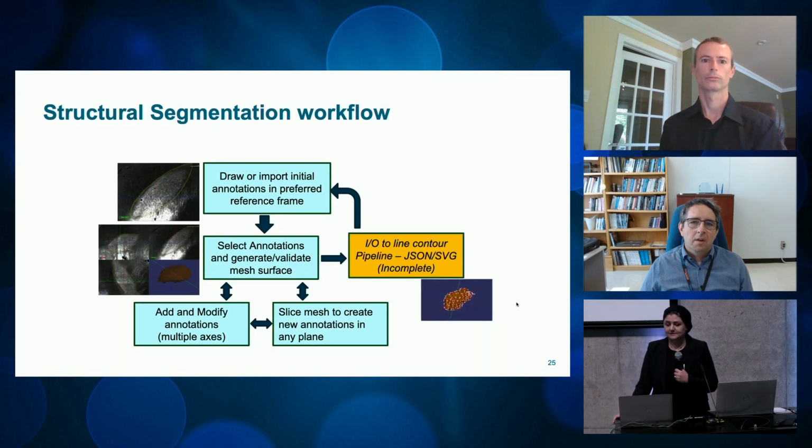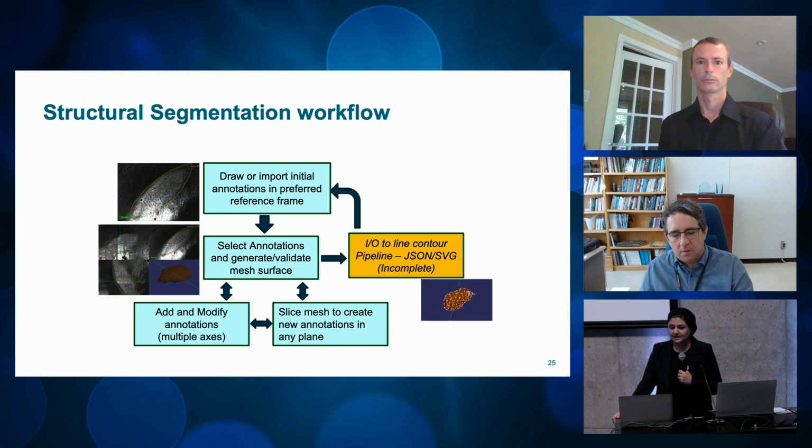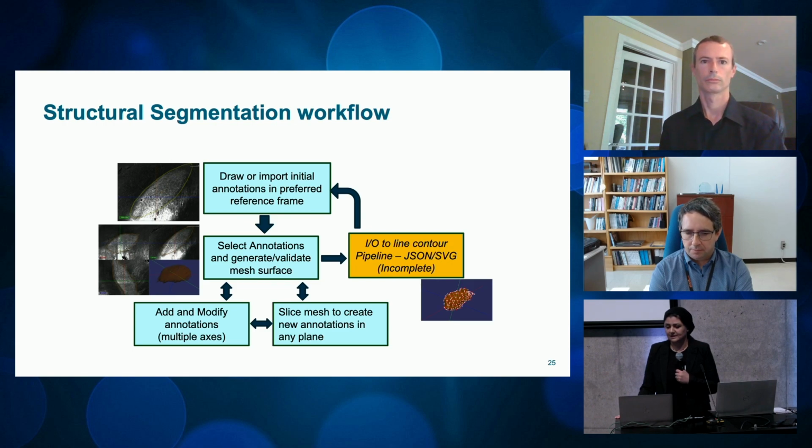Here you can see Sherry's work, which she has worked on this surface extraction on hypothalamus, and she has used the same workflow where she has painted in the coronal plane and then created the 3D surface. And next, using the A3D, she calculated the 2D surfaces, 2D boundaries in sagittal plane, and after that, using the A3D, she created the 3D surface.